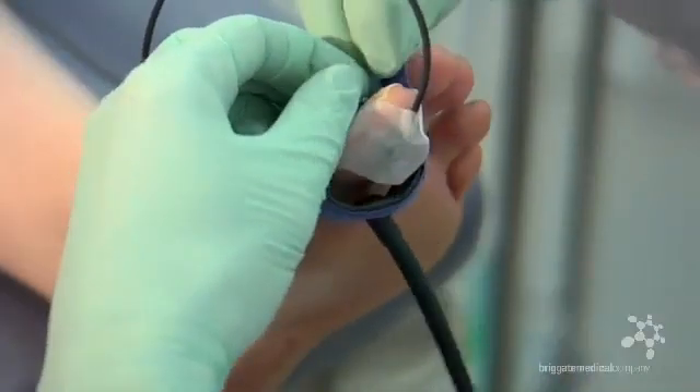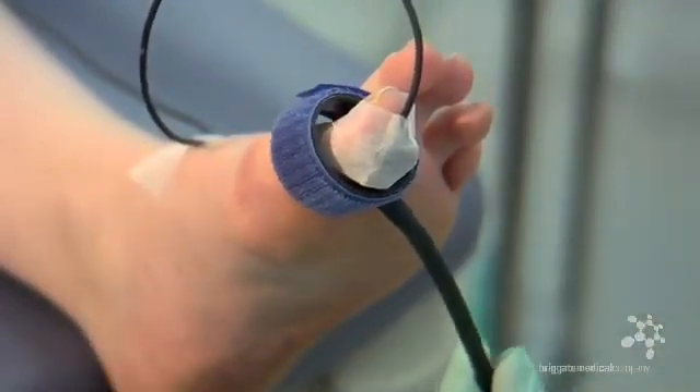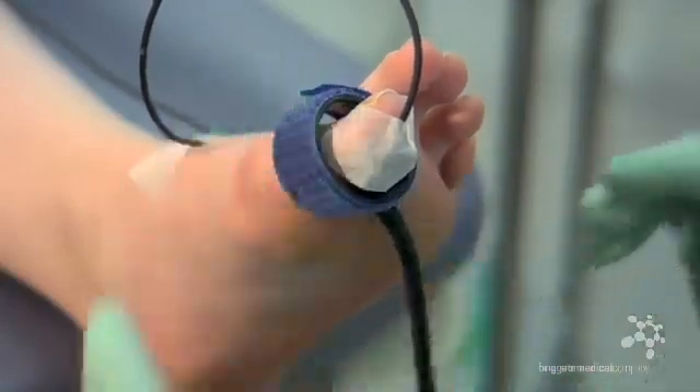Once this is done, loosely wrap the digital cuff around the toe. It is important not to wrap this too tight. Couple the air tube to the digital cuff and ensure that the airline does not run near the PPG probe wire, as interference can distort the PPG probe.